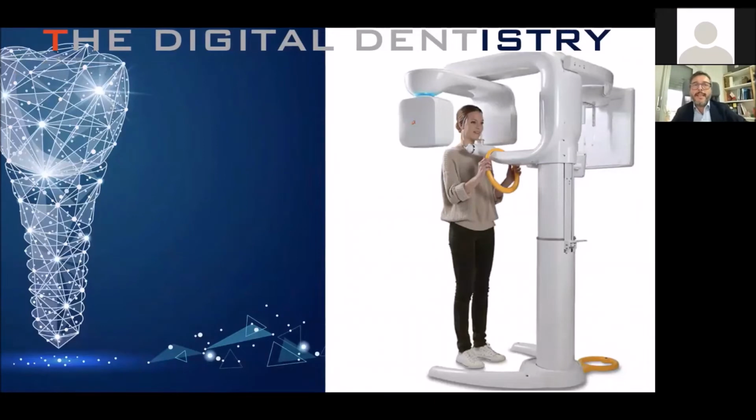Digital radiology, established in dentistry during the 1980s, is in no way considered to be less good than conventional film. In 2007, the ICRP updated the radiation and the tissue weighting factor for brain tissue, salivary glands, oral mucosa, and the extrathoracic airways, based on the latest available scientific information. The risk-based study by Ludlow et al. recommends further reducing X-ray usage in the head and neck area.